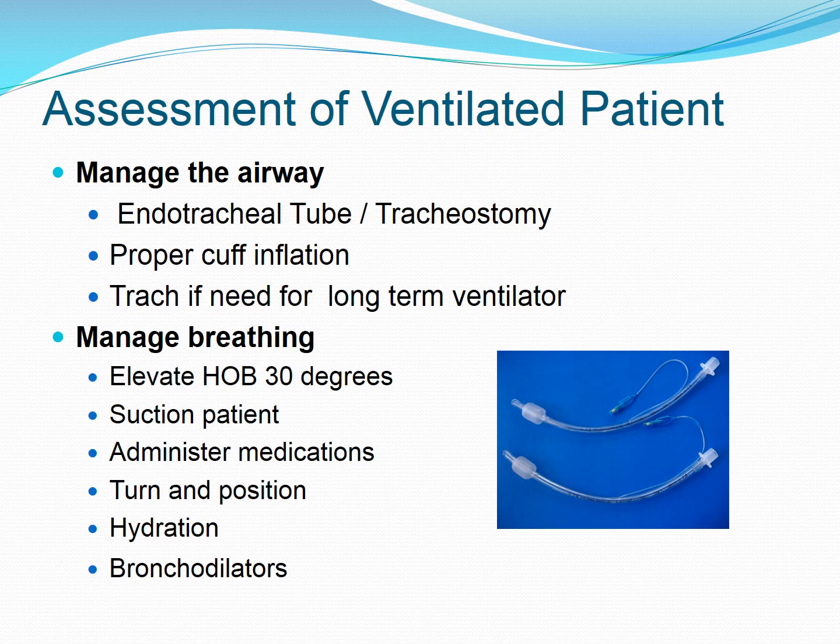We used to instill a little bit of normal saline into a port off the endotracheal tube. They used to be in these little pink things, and they called them pinkies. We don't do that anymore, because we're putting that fluid in there, and our concern is if that fluid sits in there, then we have to worry about infection.